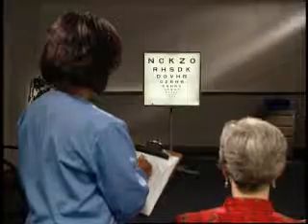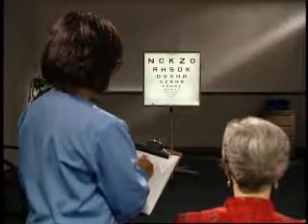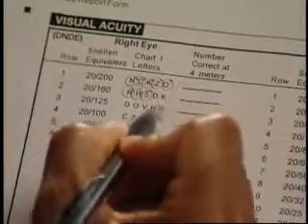N, C, K, Z, O, R, H, S, O. Oh no, that's a D. The examiner can then score that letter as having been read correctly. Subjects who make an error but correct themselves after reading the next letter in the sequence cannot be given credit for that particular letter. H, S, O, K.